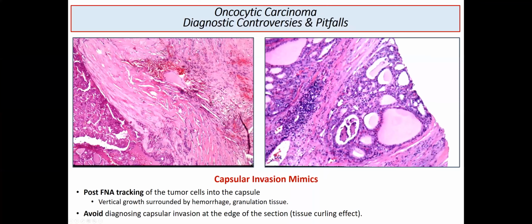The other thing that I want to mention is the curling artifact. Do not diagnose capsular invasion at the edge of the section, because there is this curling artifact which can mimic invasion.